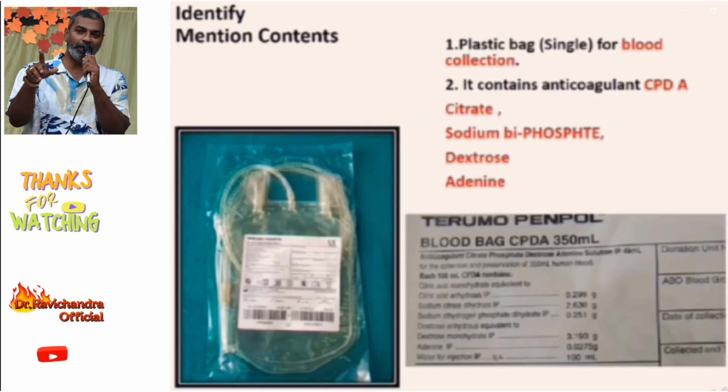In blood donations, we will use bags. So this is a plastic bag for blood collection. It contains anticoagulant CPDA. C stands for citrate, P for phosphates, that is sodium biphosphate, D for dextrose, and A for adenine. It is used for blood collection.